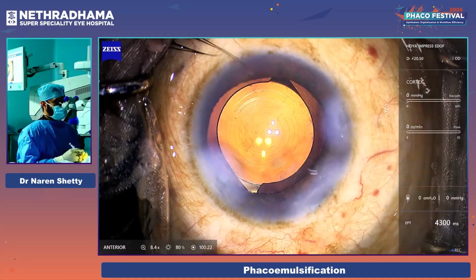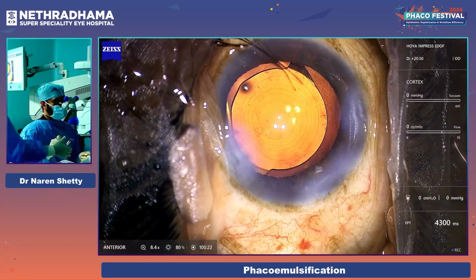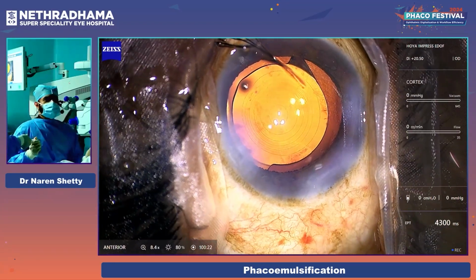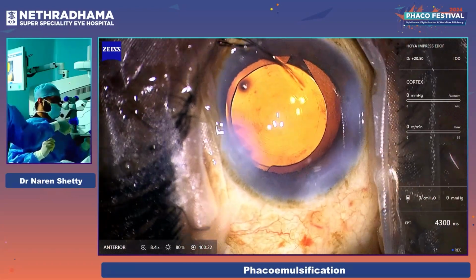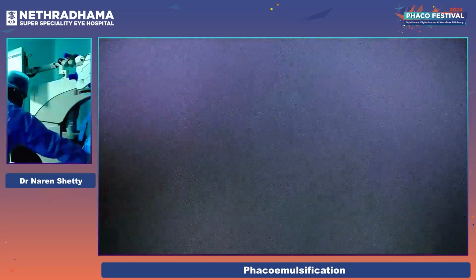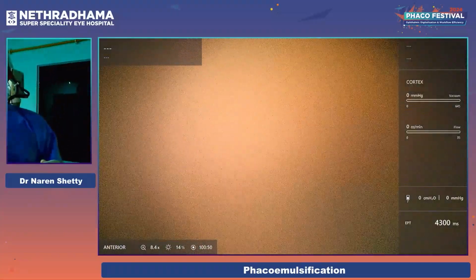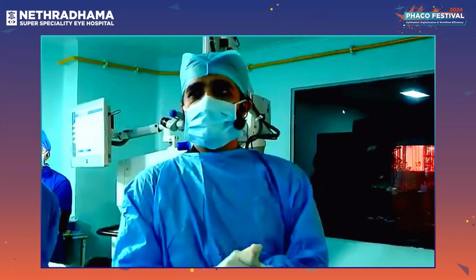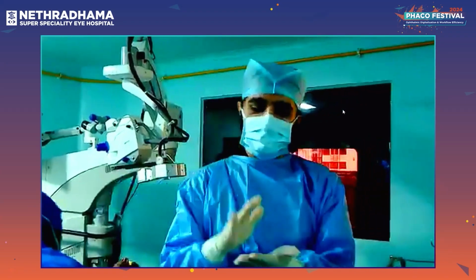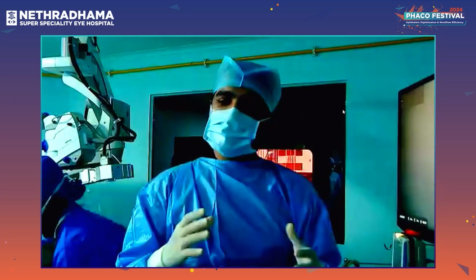Now, what is important once you finish, and this is something that all of us should do: we remove the speculum and we don't just leave without seeing the eye. It's very important to look at the eye pressure once you release it, and then only go. A lot of times we remove the speculum, the IOP reduces, and because of that, the next day the patient sometimes has a higher risk of infection, or because of the hypotony you can have a more edematous cornea. So always remove the speculum, check the IOP, see whether the eye is taut or not, and then only close the eye.